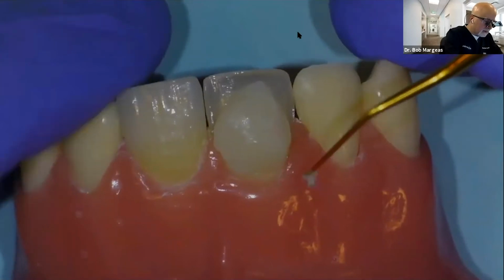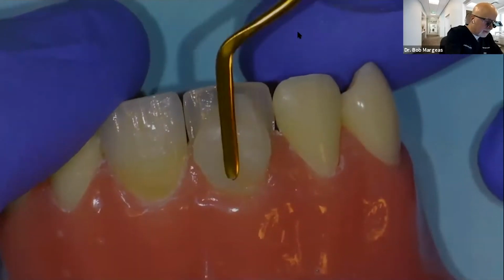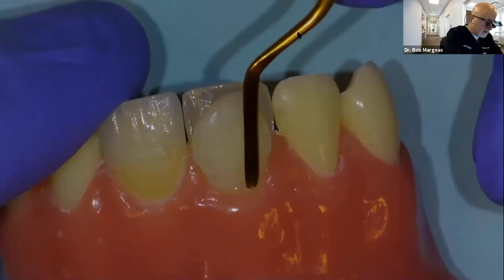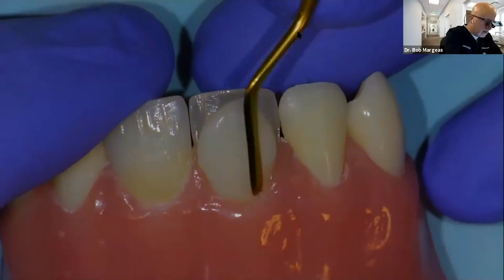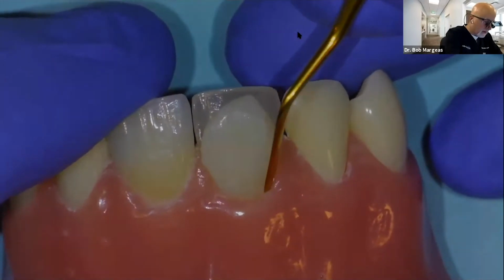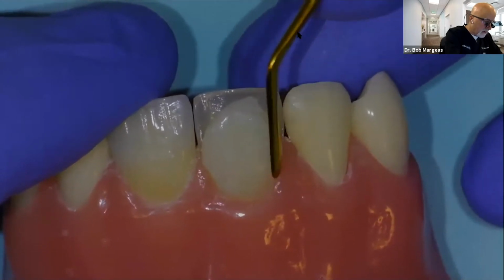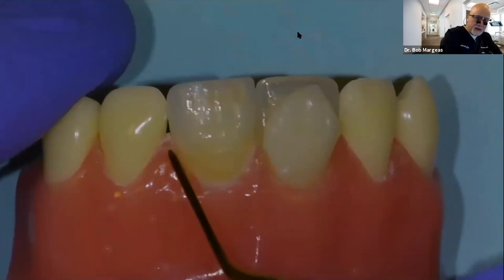I get something, a bleb in there or a speck. And what I'm doing is I'm bringing this down to the incisal edge. Notice how I'm trying to adapt this first to the margin at the cervical. That's why you need a very, very thin instrument like this REJ4. And you notice that in the interproximal, there's a lot of translucency.